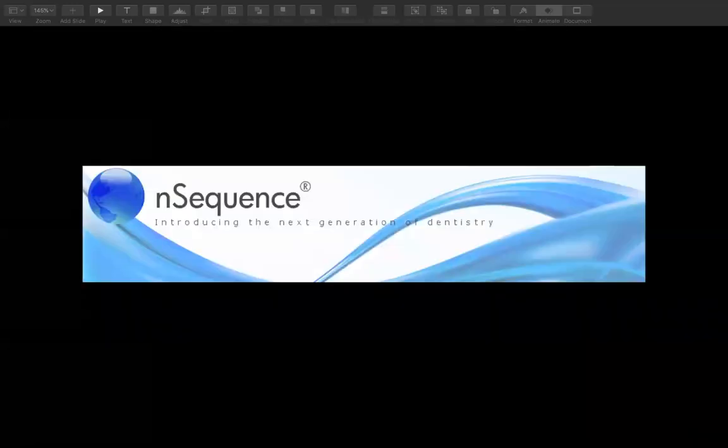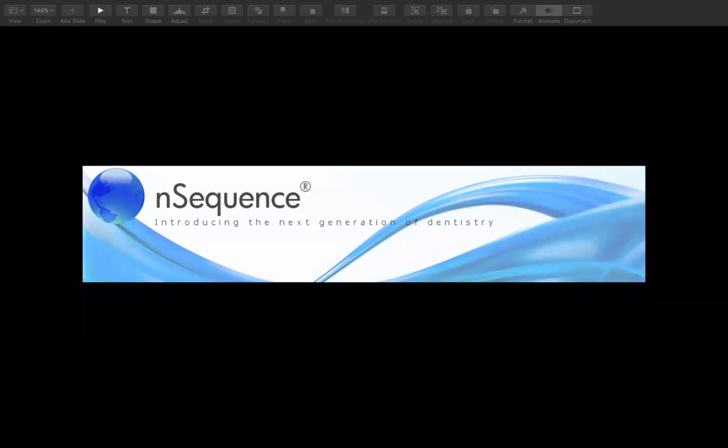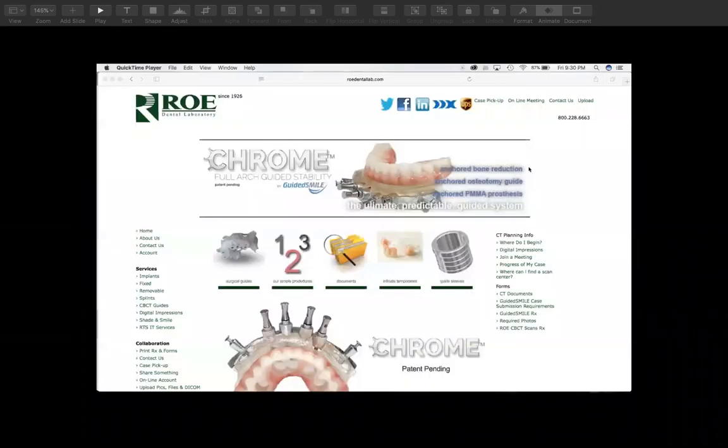There are sequences out there through National Dentex, and I have been chairside to do the conversion for these systems. They're very nice, very thorough, very robust systems, very similar to what you're doing, but the prosthesis is already made. It sits on a platform. You inject the material facially to pick up the temp copings, and you're ready to go. You don't even have to have the patient bite into it because it's based off of the models and the scans, and it's all based off of their bite and the models. So these work very well, but these are out there. Just wanted you to be aware.